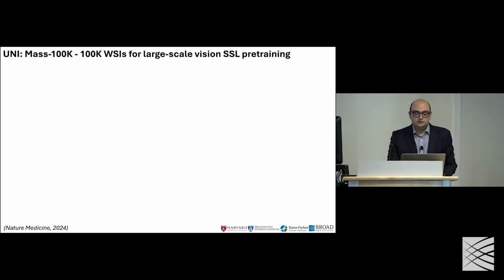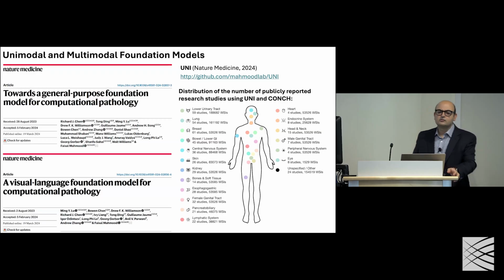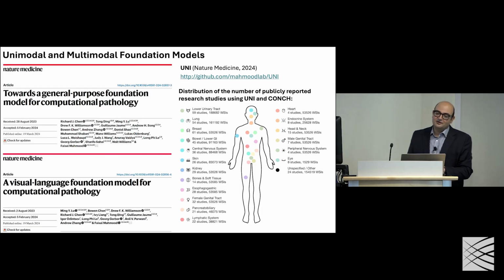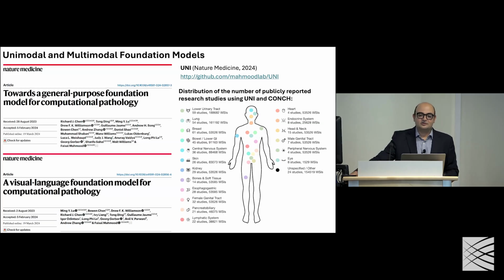Sorry, could you define what you mean when you say looking for the most unique pathology images? Is that defined by a pathologist, or is there some sort of metric for diversity? We looked at a number of different ways. You could just embed all the pathology reports and see in feature space how they separate. That's what we initially did, because we have 22 million pathology reports.